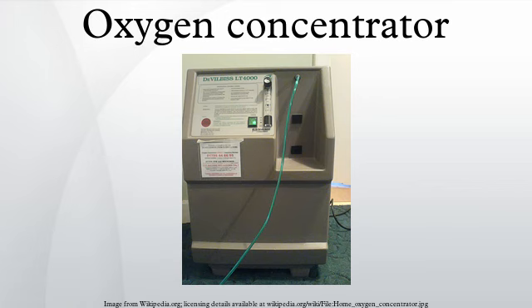Research into oxygen concentration is ongoing, and modern techniques suggest that the amount of adsorbent required by a medical oxygen concentrator can be potentially reduced by a factor of 3 while offering a 20% higher oxygen recovery compared to a typical commercial unit. These portable concentrators typically plug into an electrical outlet and may have an internal battery or external battery pack for operation away from home.